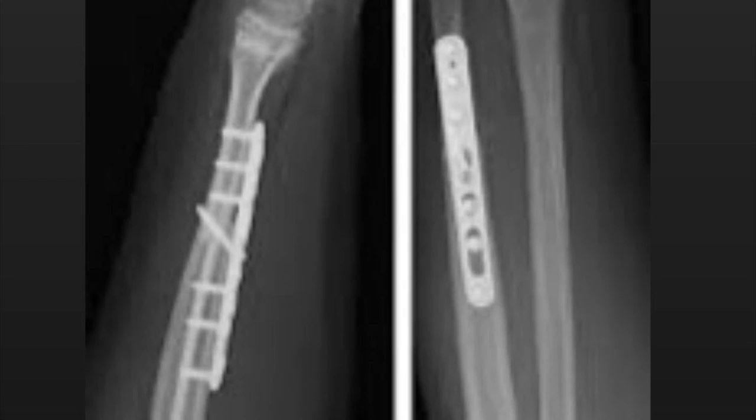Here is a picture of a ulnar shaft after getting plates and screws — what we call open reduction internal fixation, or ORIF.